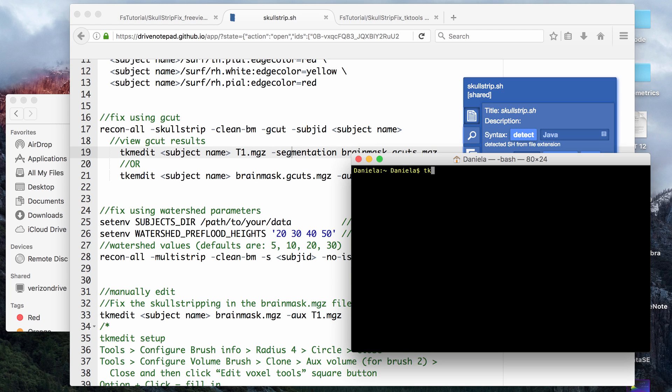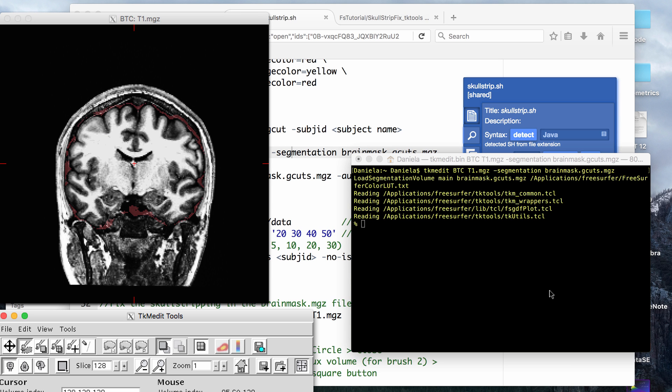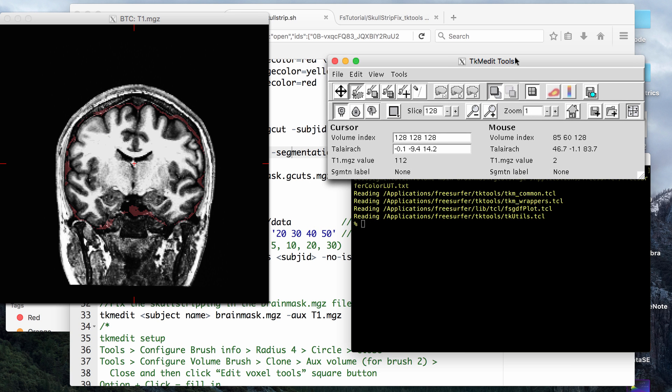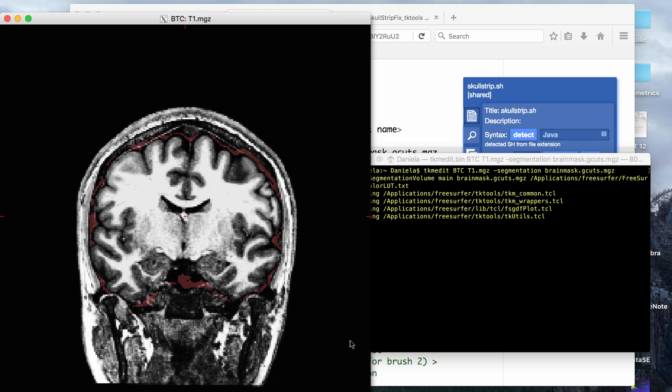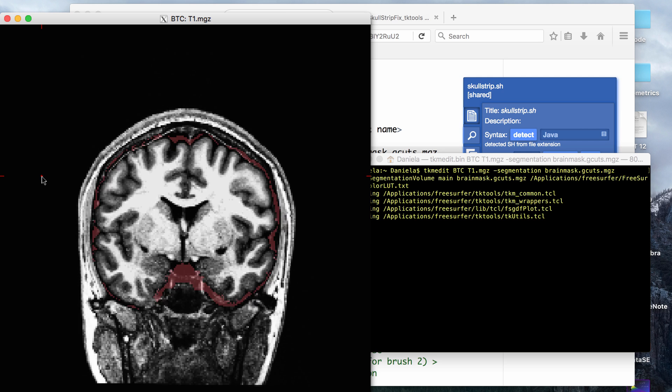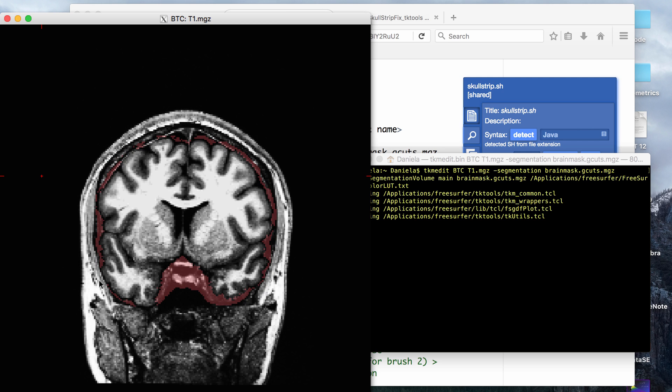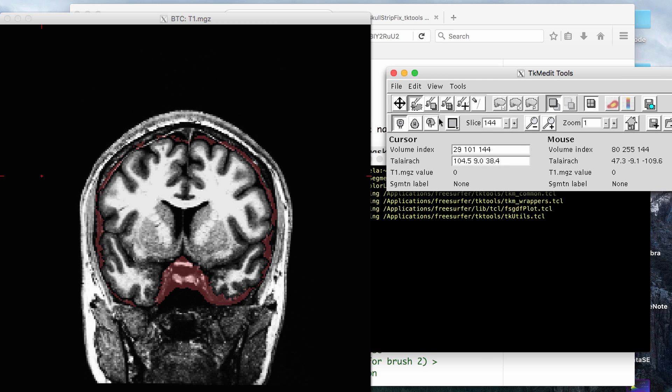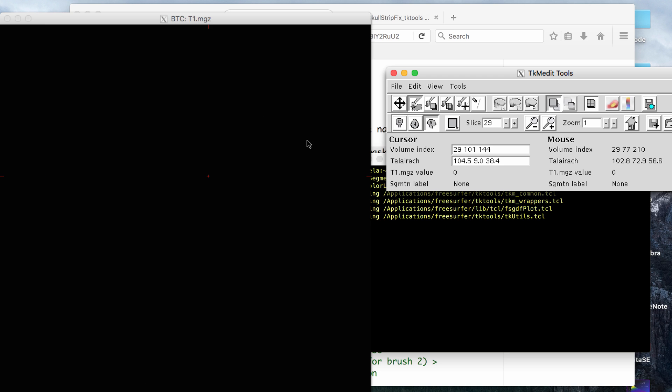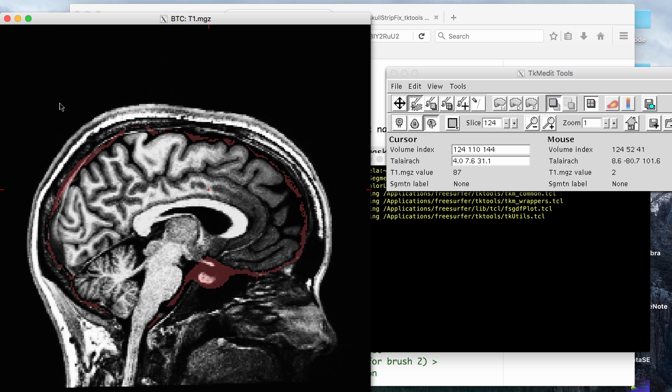So to view gcut results, if you want to view it like this where you have a red border of what gcut removed, then you can use this first line. So that's tkmedit, then the subject folder name, t1.mgz, segmentation, brainmask.gcuts.mgz. Okay, so that opens tkmedit, and this is a good way to view the gcut command because if you're going to go back and manually edit, if you think that gcut took away some brain tissue, then you can cycle through here and see what gcut cut out, and it's a good way of seeing where you have to go back in to fill in brain tissue, if anywhere.